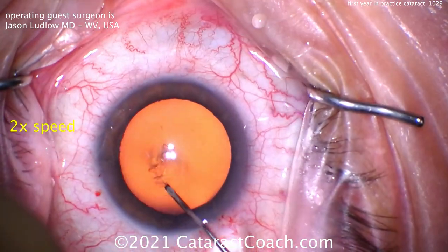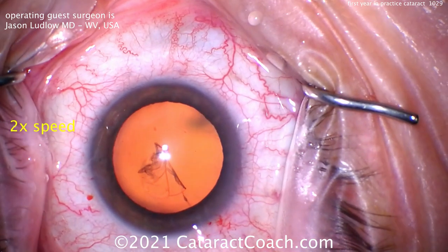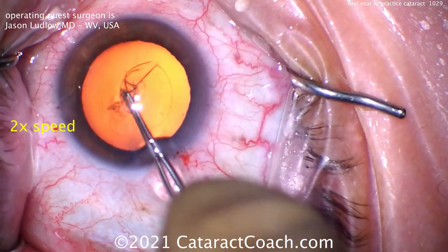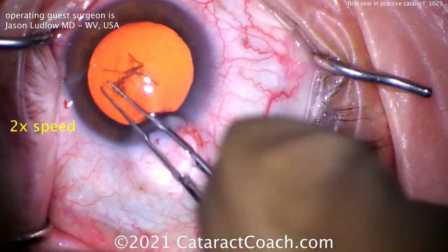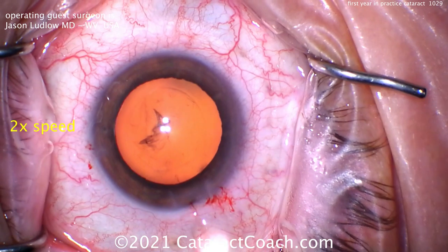Time for the capsular rhexis. When you're starting off, this is one of the most challenging parts of the surgery. As you get more and more experience, this becomes one of the most fun parts — the satisfaction you get is amazing. Let's see his rhexis. Looks really nice. Good technique, pivoting in the incision, keeping the flap turned over and continuing it. That's a beautiful rhexis. Fantastic. About five millimeters, it looks like.